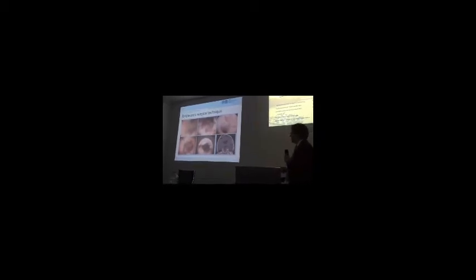Okay, so this is a typical post-op. Let's see if this video runs. Yeah, no, we have to be patient, otherwise it stops running. So it's a typical case.